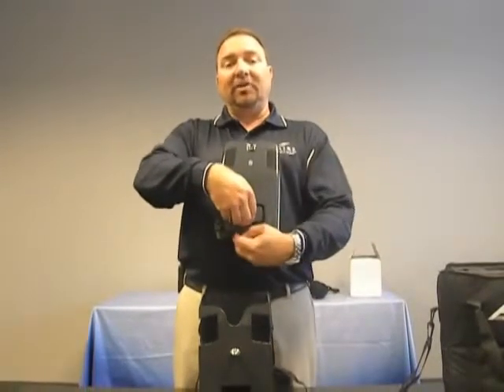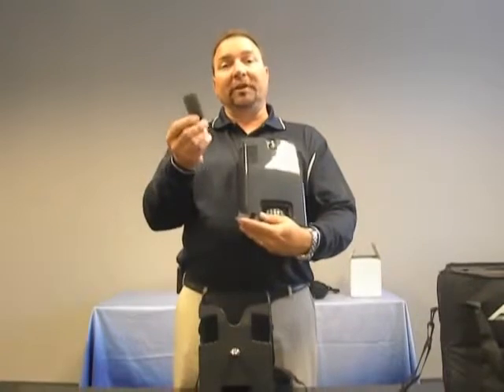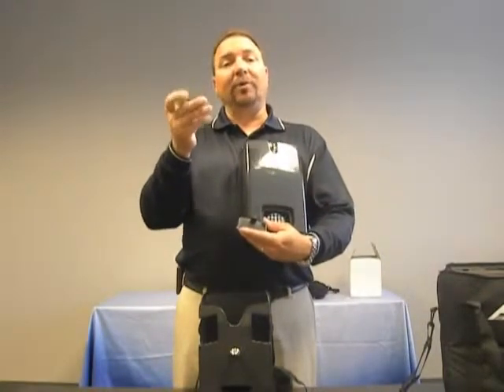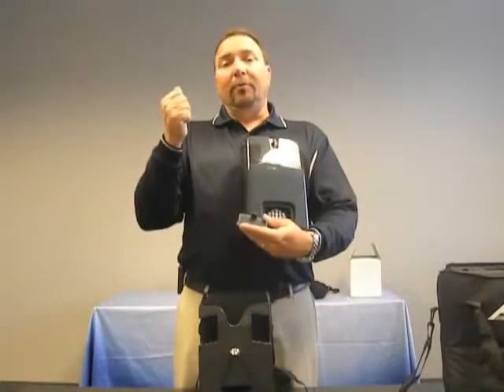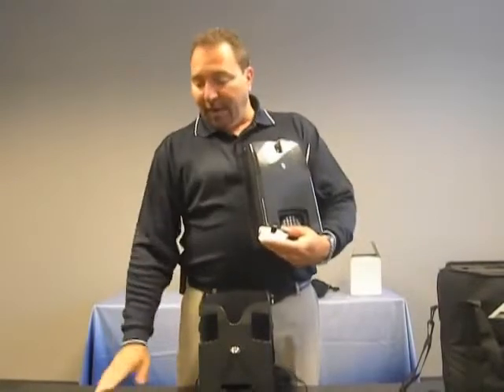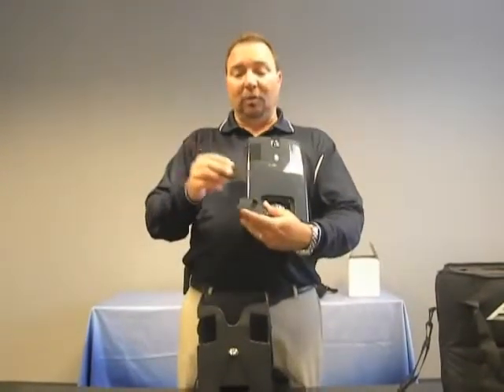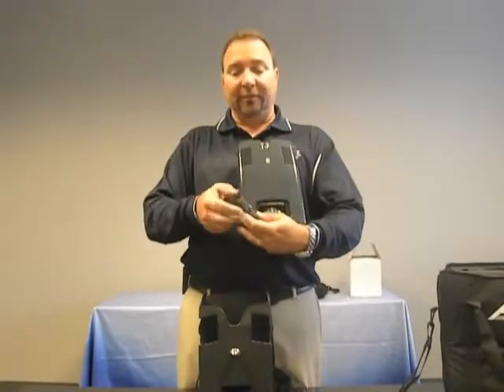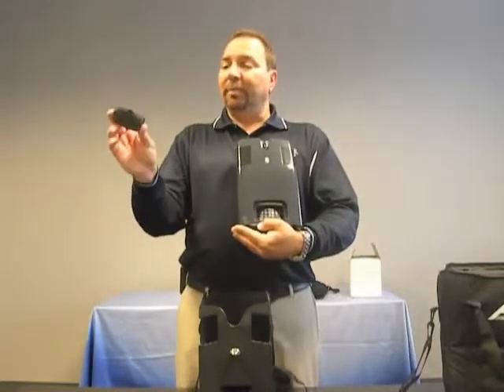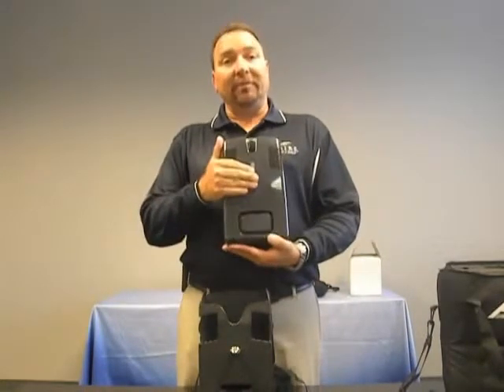Basic maintenance that the patient will be required to perform is a weekly washing of the gross particulate filter. This can be done by simply rinsing the filter out with warm, soapy water, removing as much of the excess water that is inside the filter, and perhaps pressing down on a paper towel to remove any additional water droplets that may be inside the filter. Upon completion of washing the filter, you can simply put it back into its holder, and it is pushed back into place at the bottom of the FreeStyle 5.